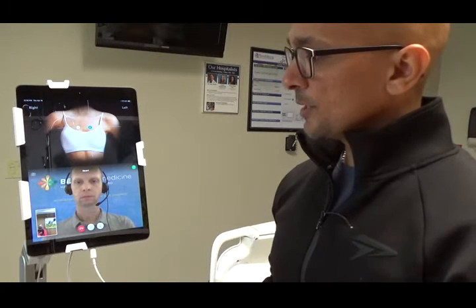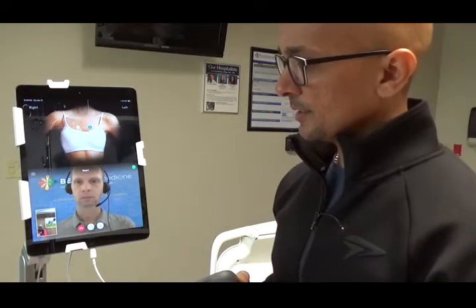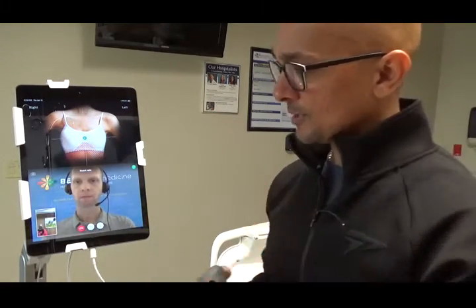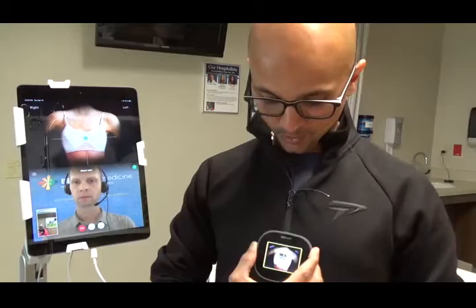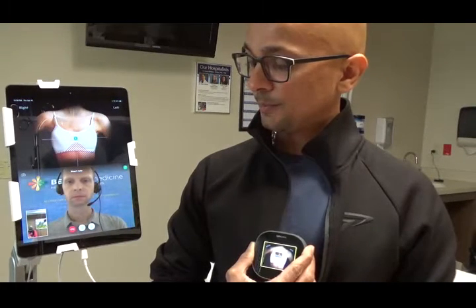And then the other one we could try is the pulse, if you want to try. I think it's just the heart with the EKG tracing. So this is for the pulse, which I don't know if it's going to work here, but we'll try. You pretty much put it in the middle, and you may have to start a timer.